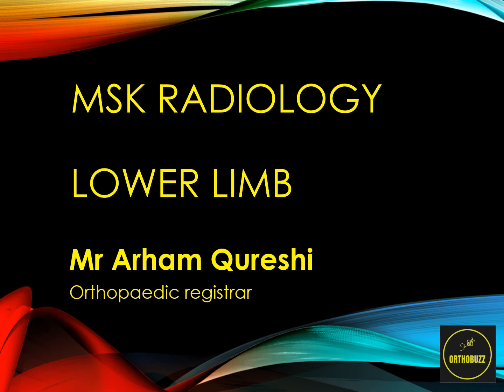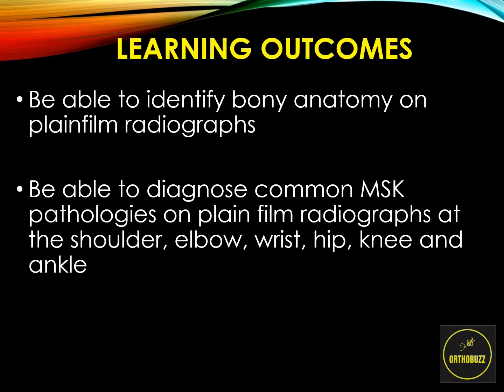Today we're going to be focusing on musculoskeletal, orthopaedic radiology and presentations of lower limb injuries. So what are the learning outcomes? Well, we're going to look at bony anatomy on plain film radiographs and then go through some lower limb orthopaedic presentations and cases at the hip, knee and ankle joint, and how we're going to focus on management of these injuries, particularly in the emergency setting.